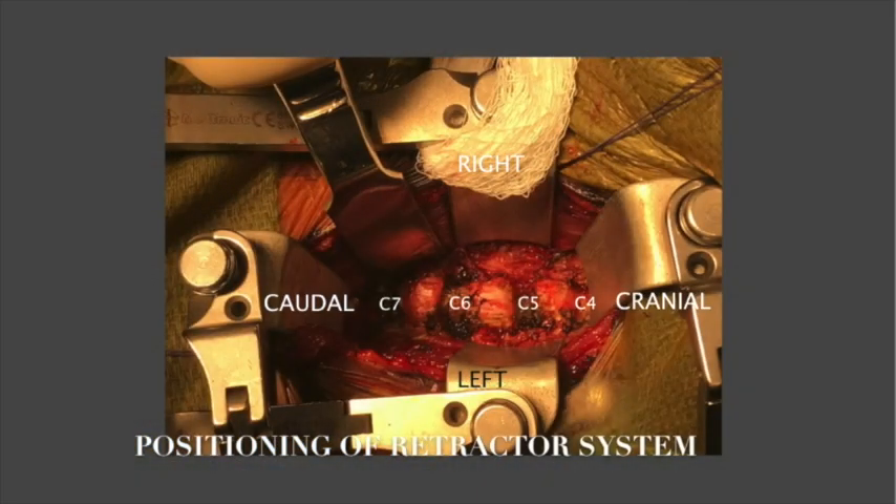Superior and inferior exposure were obtained with a pair of retractors. The final aspect of exposure is seen with the surgical field prepared for a three-level anterior microsurgical discectomy, with the anterior aspect of the vertebral bodies from C4 to C7 with adjacent intervertebral spaces.